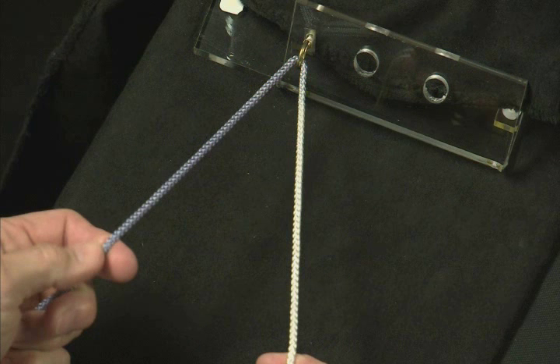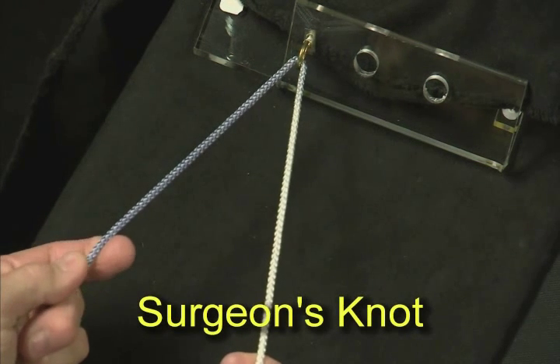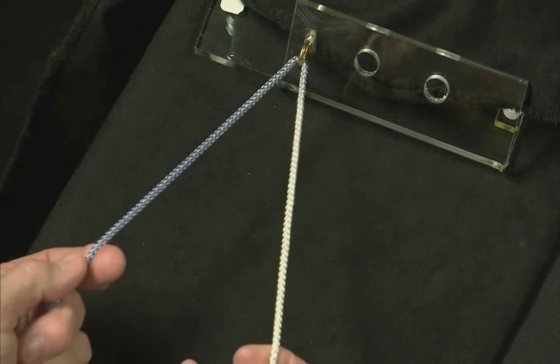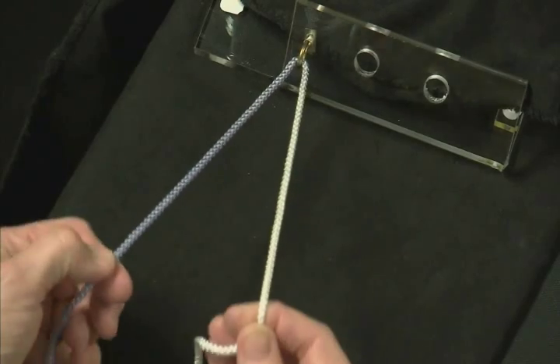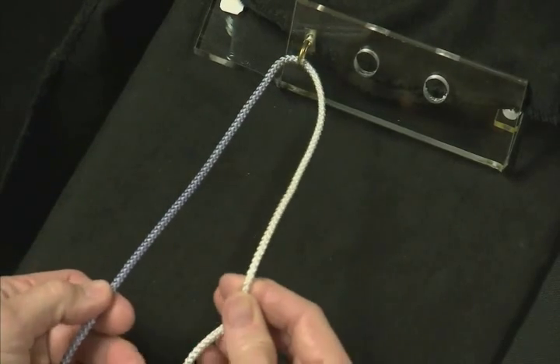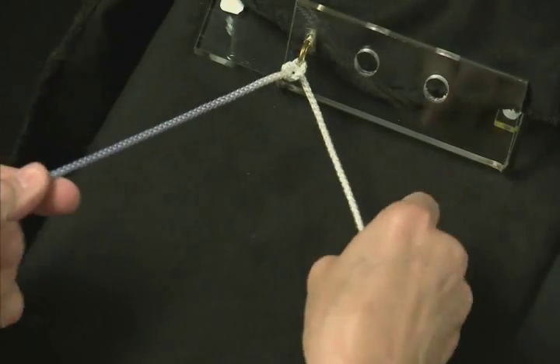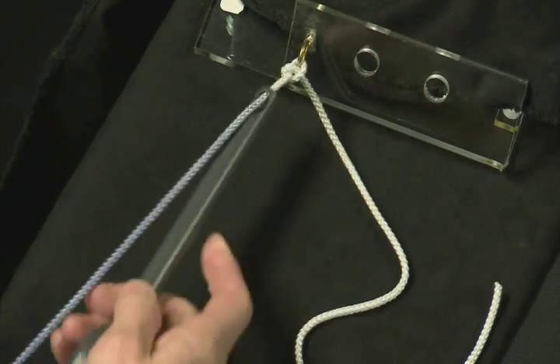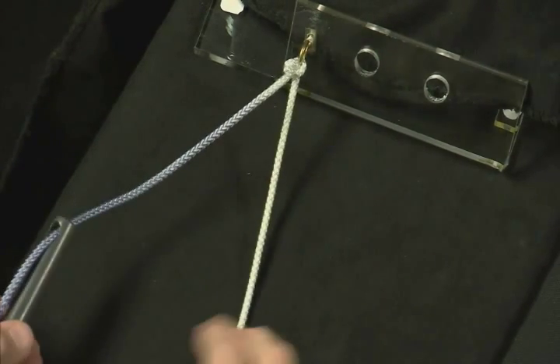Dr. Ireland here demonstrates the non-sliding types, beginning with the surgeon's knot and half hitches. A surgeon's knot, where basically we have three underpasses on your base knot, and then do three reverse half hitching alternating posts. So you want to be equal in your post and your limb, and so we'll do an under. And you push this down each time with your knot pusher, so your knot pusher is going to be on your post. You're pushing it down here, keeping tension here, and then we're going to do another under.